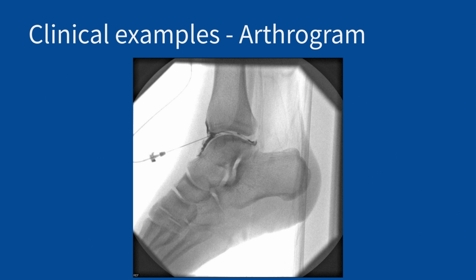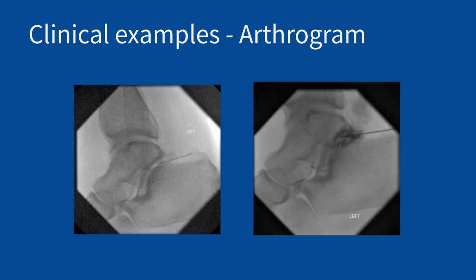And so you may actually be eliminating two pain generators, or eliminating a pain generator that you were not able to identify. So there certainly is added value of doing that under contrast with fluoroscopy. Here, an example of a subtalar joint injection.